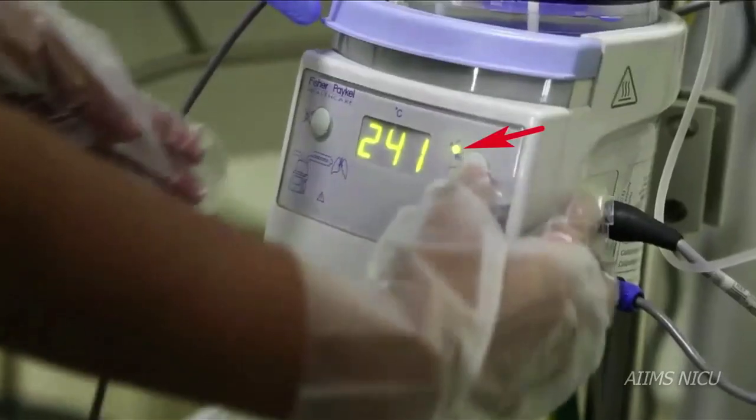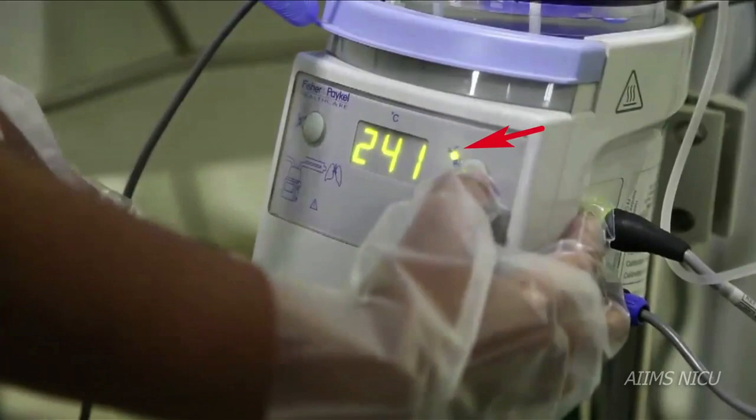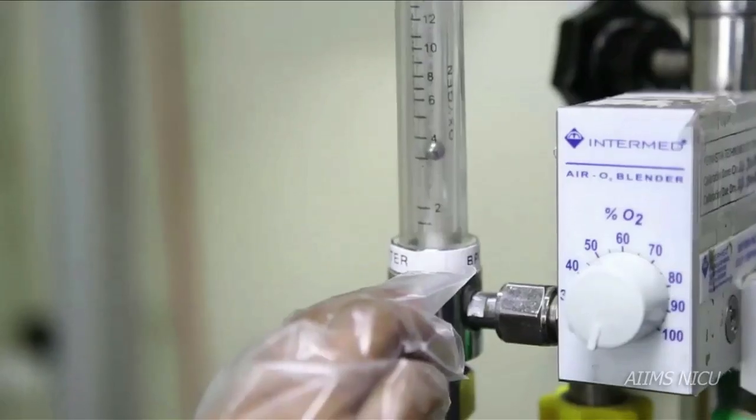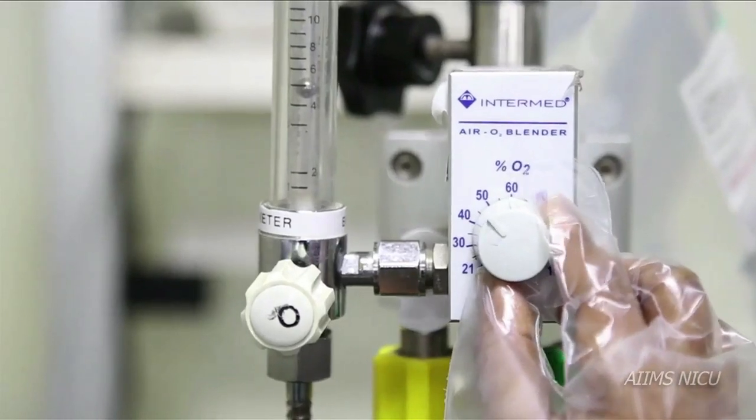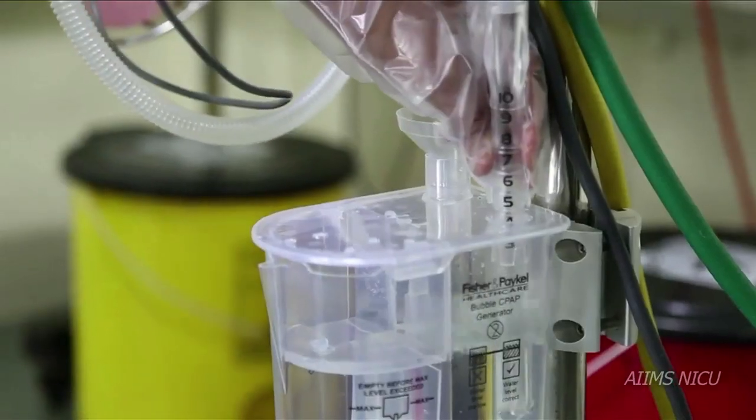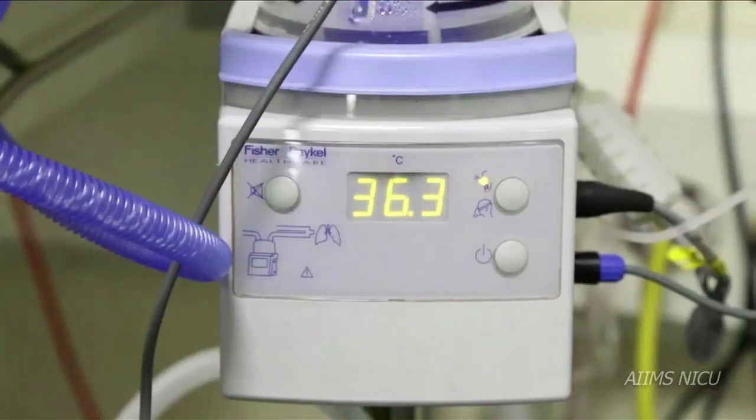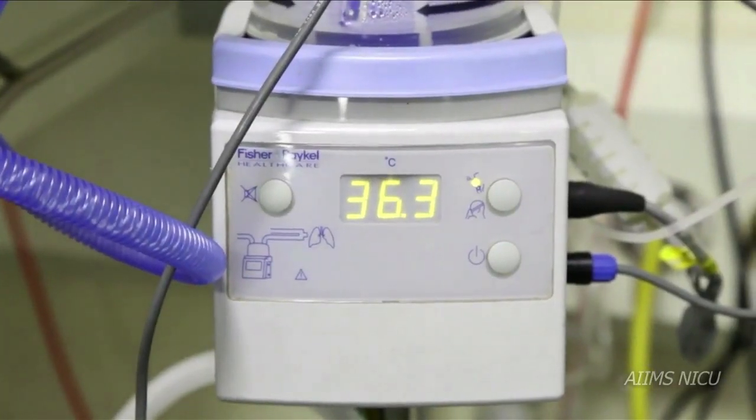Switch on the humidifier and set in invasive mode as shown here. Watch for bubbling in the bubble chamber. Set the FiO2, flow, and pressure to appropriate level. Wait for the humidifier to display a temperature of 37 before connecting the circuit to the patient.